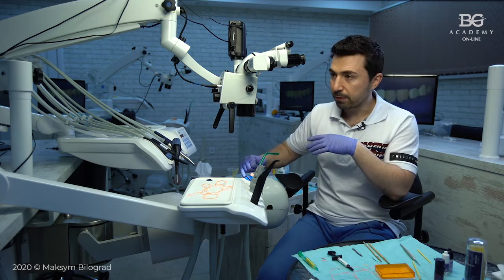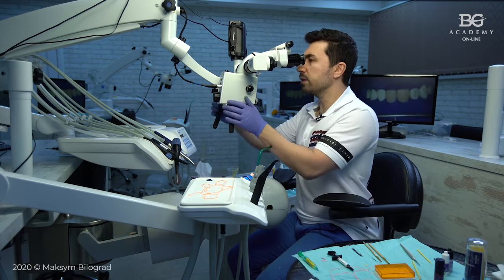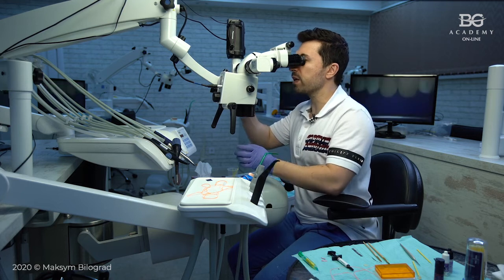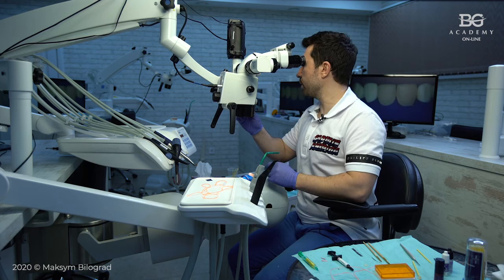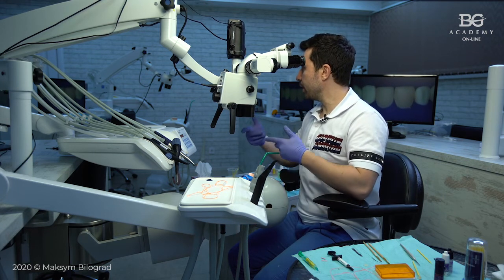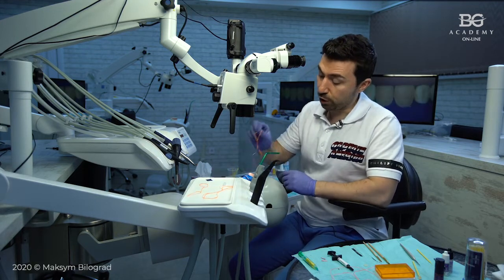And in that type of isolation, to get your finish lines exposed better, let me just check, show you, sorry, I will go for higher magnification. We can use additional isolation tools like clamps, for example, or you can use floss ties.